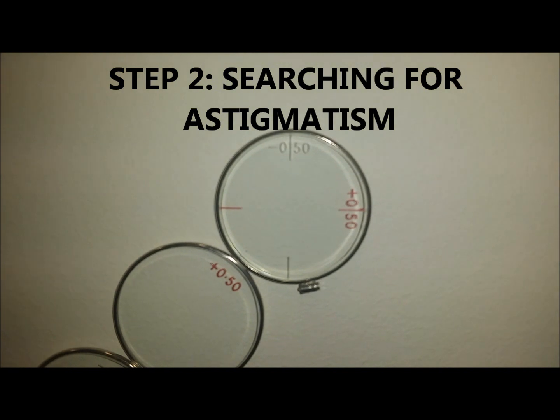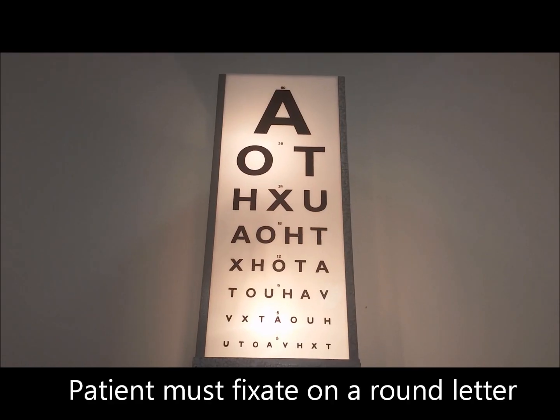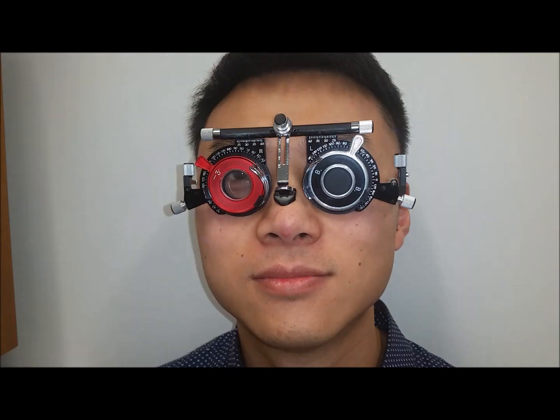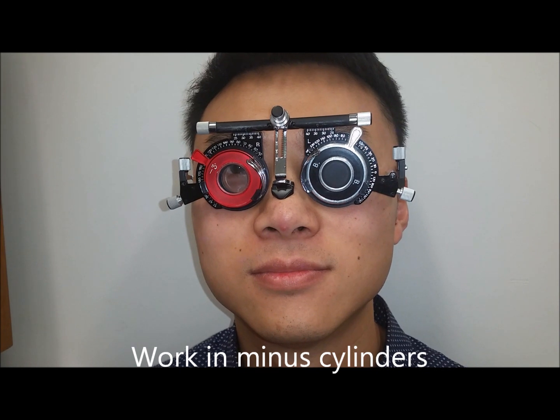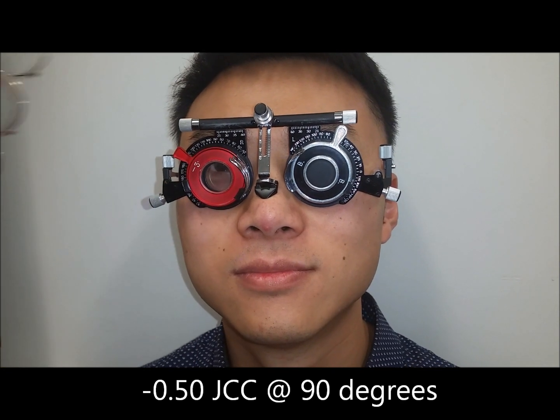Step 2. Searching for astigmatism using the Jackson cross cylinder. So I'm just going to get you to look up at the O on the lowest line you can read for me. Natasha will begin by presenting a minus 0.50 Jackson cross cyl at 90 degrees. It is preferable to work in minus cylinders. Yep, so Hongbin, I'm just going to get you to tell me if it's better with or without.